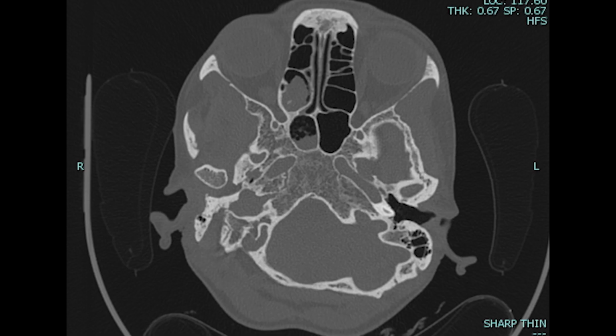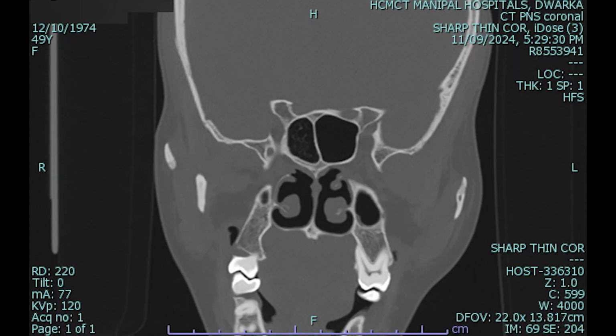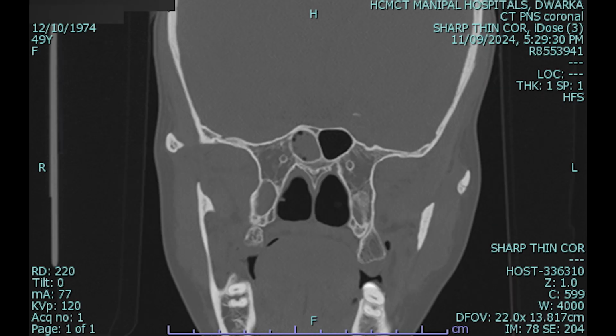This is the CT scan of a patient with right-sided sinusitis that basically involves the posterior ethmoid and the sphenoid to some extent. What we can see is a very well-defined soft tissue density inside the posterior ethmoids that is having convex margins, so it's definitely not fluid. It is localized, as well as some evidence of acute sinusitis, some fluid inside the right side sphenoid sinus that could be resolving as well, and with some occlusion of the spheno-ethmoidal recess. You can see some soft tissue in the sphenoid on the right side as well.